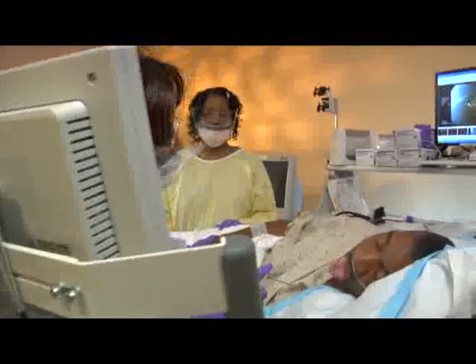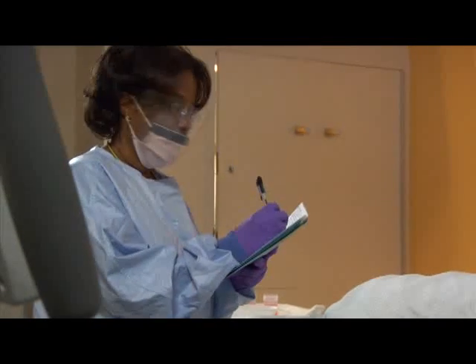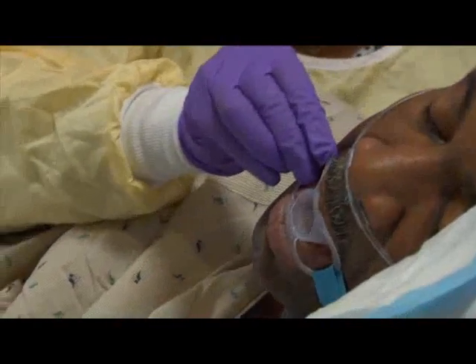During the procedure, everything will be done to help you be as comfortable as possible. Your doctor may give you a sedative. The drug will make you relaxed and drowsy, but you'll remain awake enough to cooperate with your physician. The doctor may spray your throat, or you may be asked to gargle with a numbing agent. This will help keep you comfortable as the endoscope is passed. You should feel little to no pain, and it will not interfere with your breathing. And your blood pressure, your pulse, and the oxygen level in your blood will be carefully monitored. Once you are comfortable, a supportive mouthpiece will be placed to help you keep your mouth open during the procedure.